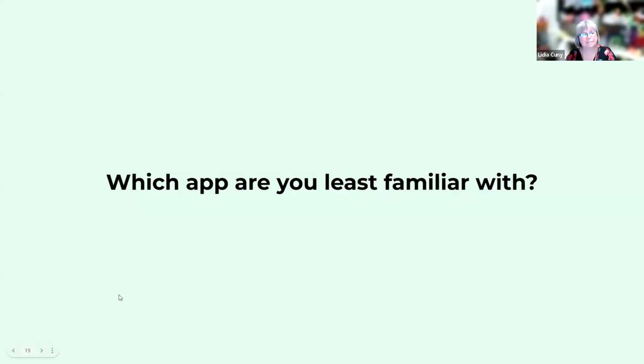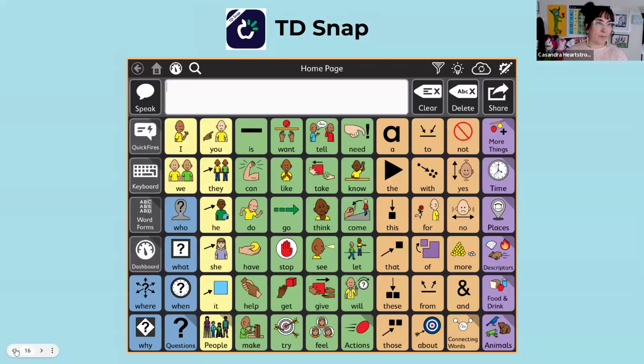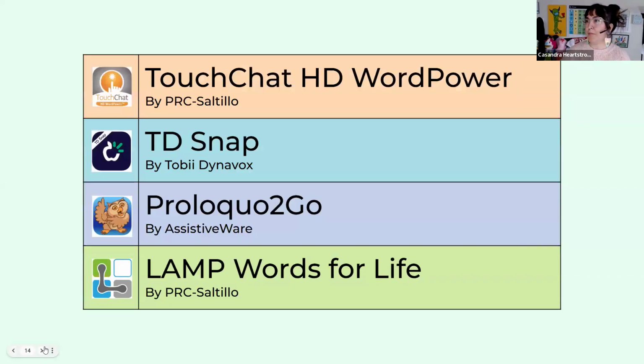What were the 4 again, besides TouchChat? And I'm going to get back there for you, Lydia. There you go.